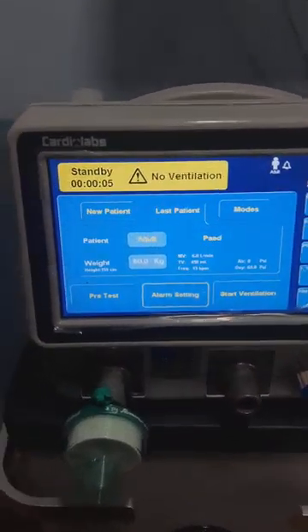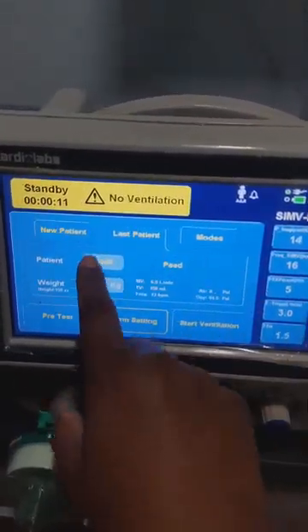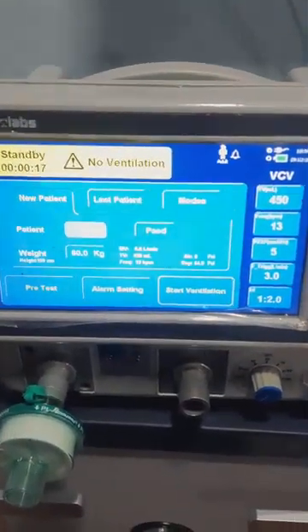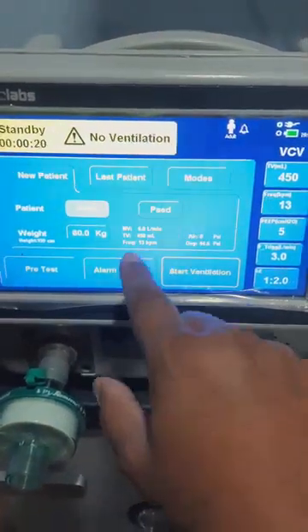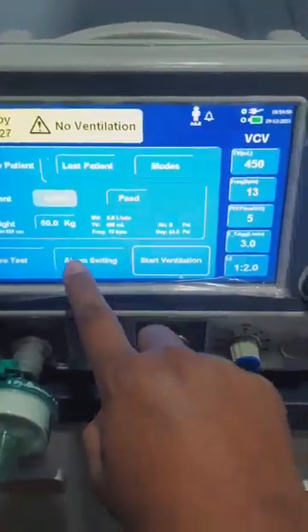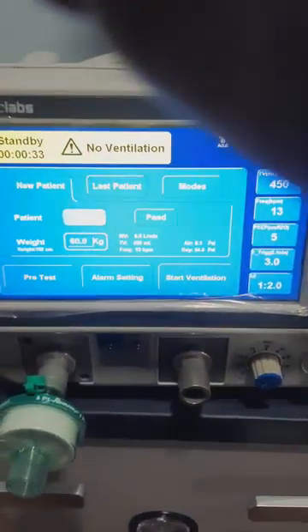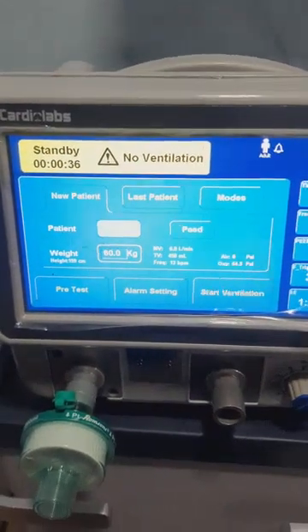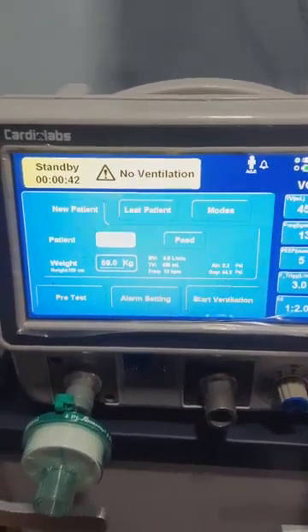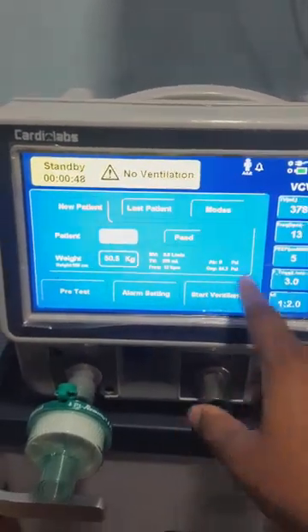Here you can see options for new patient or last patient settings. Whenever we start a ventilator for a new patient we select new patient settings. It has both adult and pediatric options, and as per weight it has preset values. So if you are handling an emergency case — for example road traffic accidents where the patient comes in unconscious or in respiratory arrest — you can directly input the weight of the patient.